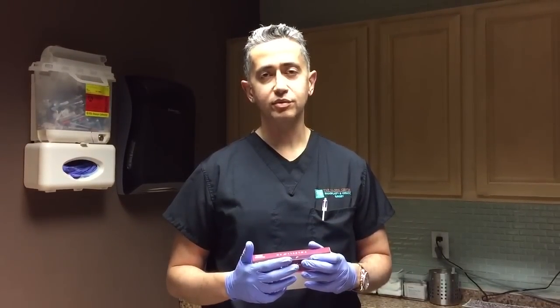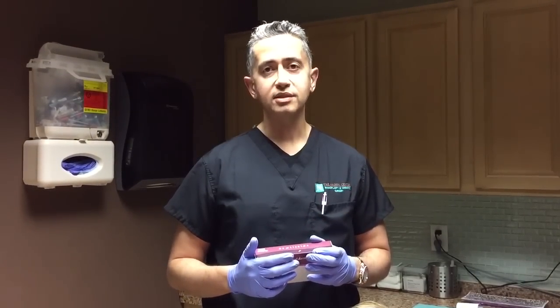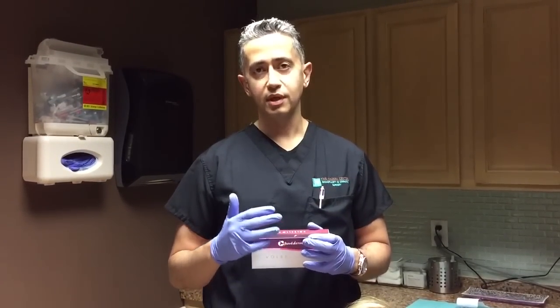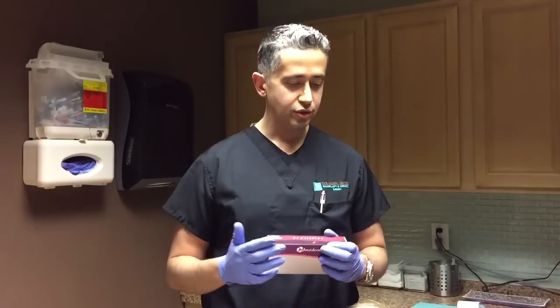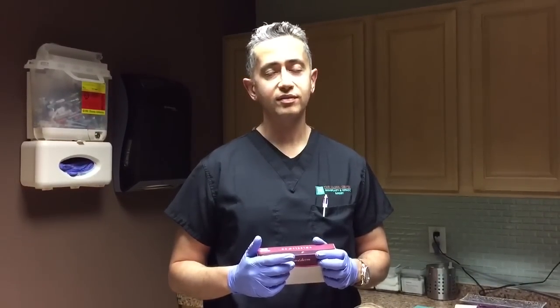Now, you've seen pictures on Instagram, you've seen pictures on our website of women who've had extremely exotic lips created by myself or my partners. That's a rare segment of the population. Most of our patients want very subtle results. Most of them want just barely noticeable results. They're self-conscious. They don't want anybody to be able to tell that they have lip injection, so we do it slowly over a much more prolonged course. And I'm going to show you the injection of Volbella and the technique. It comes in 0.55 cc syringes, and we're going to demonstrate that right now.